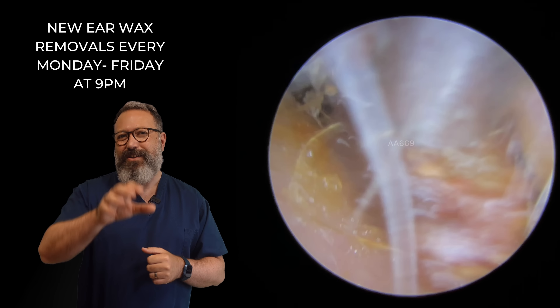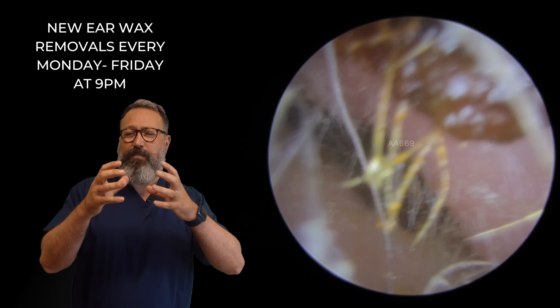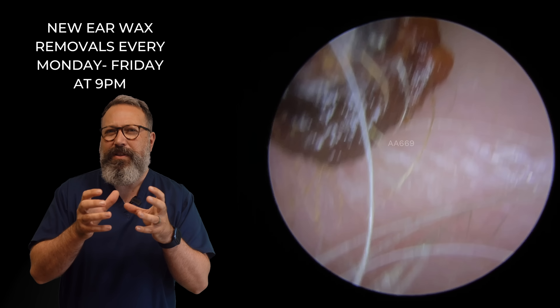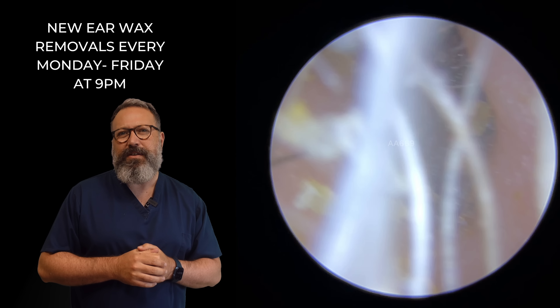And I'm trying to tease this through. Yeah, you can see it just sheared off there. We could tell it sheared off just because the front end — the movement — there was just too much movement there for it to still be attached to the piece behind. But we're getting some good-sized pieces out of this one as well.